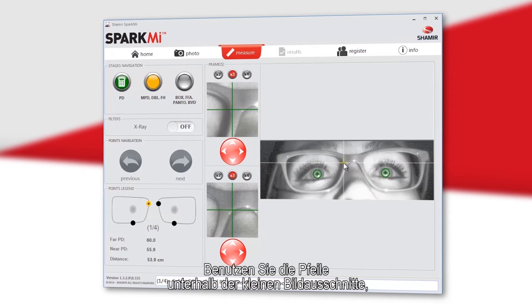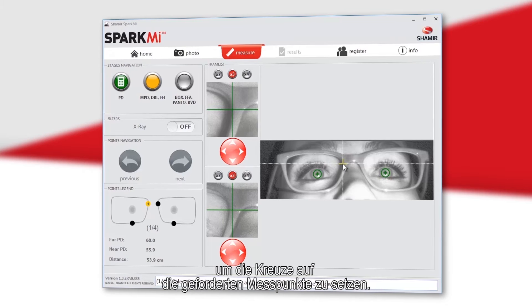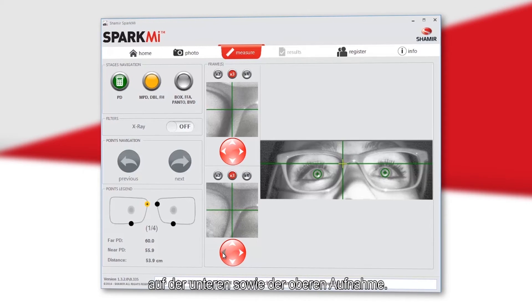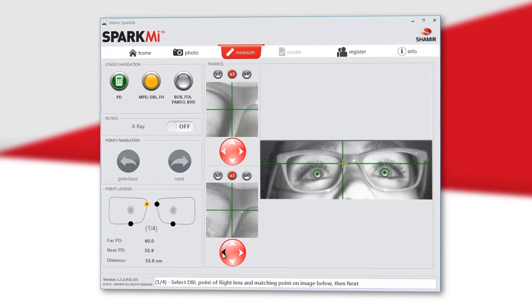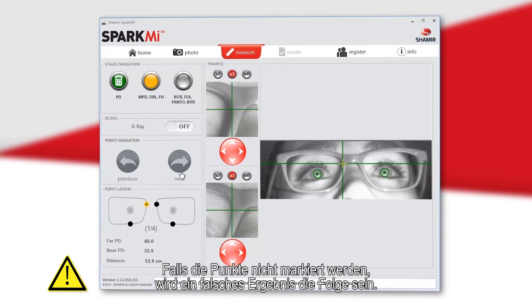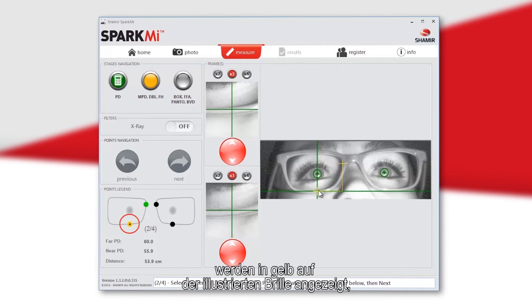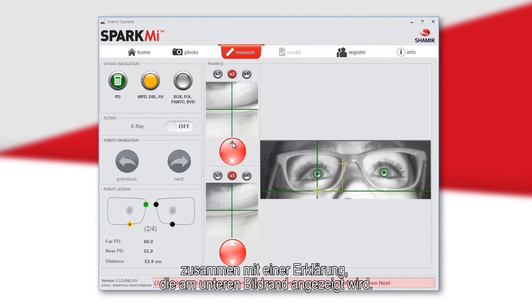On the measurement screen, you will find the patient's image where you will mark eight points. Use the arrows of both left small images to locate the cursor at the required place. It is imperative to mark all points on both the upper and lower images, as not doing so will result in inaccurate results. The point to mark is shown in yellow on the frame illustration, with an explanation shown at the bottom of the screen.